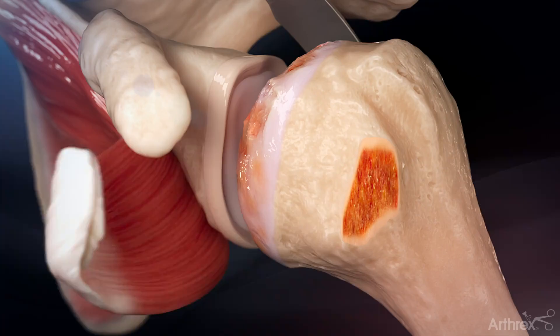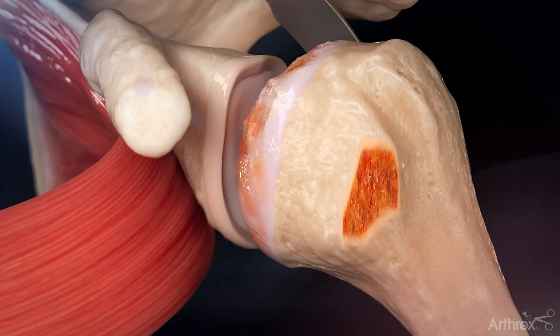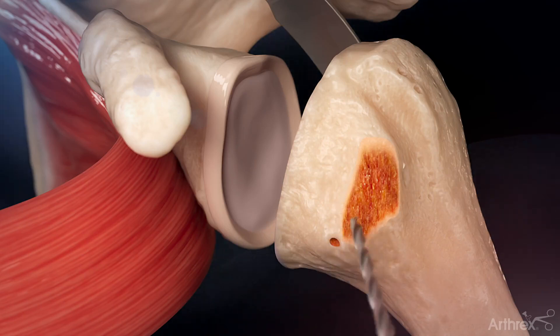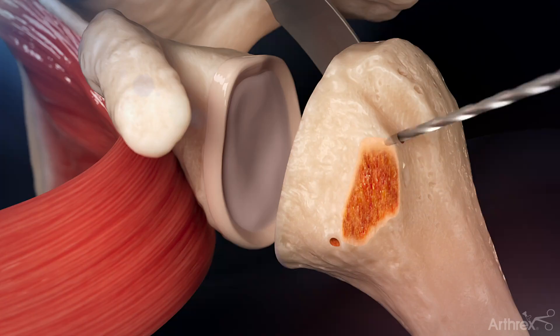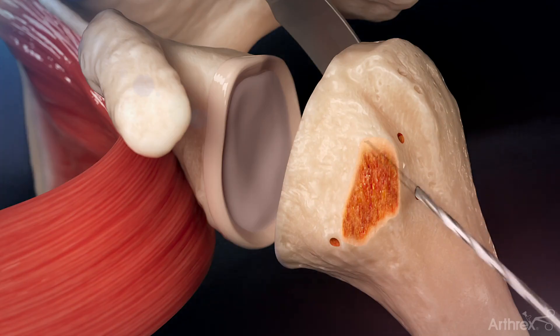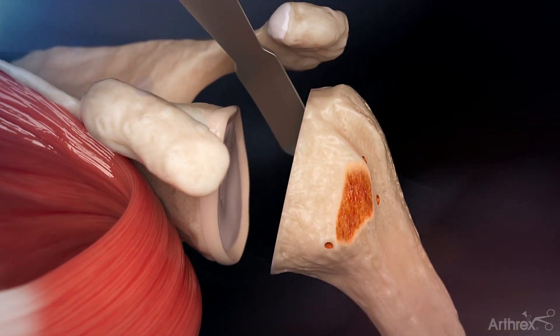After the subscapularis is reflected, standard preparation for the humeral stem is completed. Bone tunnels are then established in the proximal humerus using the supplied 2.0 mm drill bit. If a collared humeral stem is being used, only one hole is needed medial to the lesser tuberosity. Two additional holes are drilled inside the bicipital groove, spaced approximately 15 mm apart.